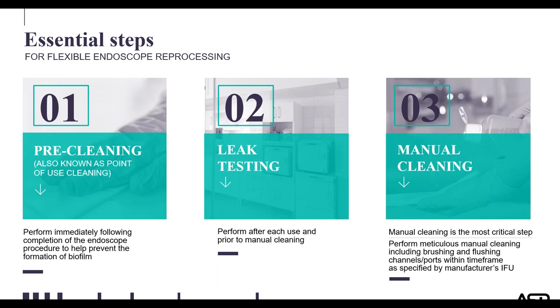Make sure that you mark the time the pre-cleaning takes place, because for some scope manufacturers, there's a time limit from the point of use cleaning to manual cleaning. And if you don't meet that time limit, you have to do an extended reprocessing on that. When transporting the scope, use a container that is leak-proof and puncture resistant. Label the transport card or container as a biohazard, and that's a regulatory requirement.